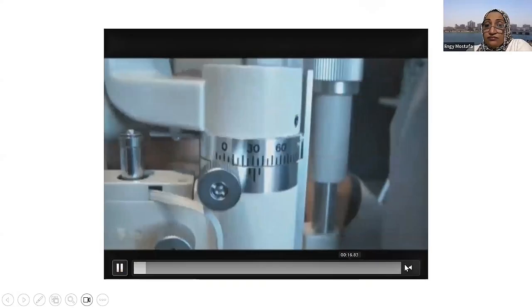Before, every time there was an angle between them. This time we are putting them coaxial so that we can reflect the red light from the red reflex of the fundus to see details, either from the lens, if it's a dilated pupil, or like this is the arcus, or this is like an oil droplet in keratoconic eyes. So this is a very perfect maneuver.